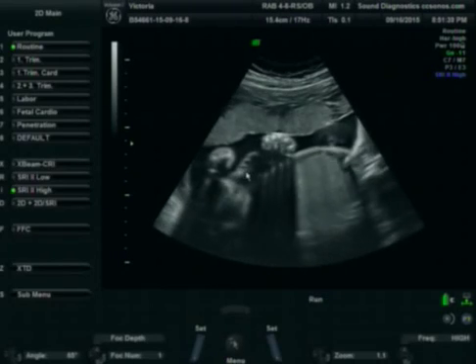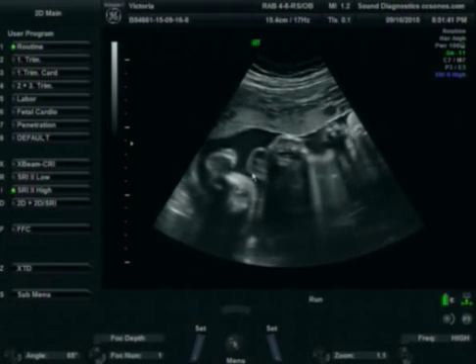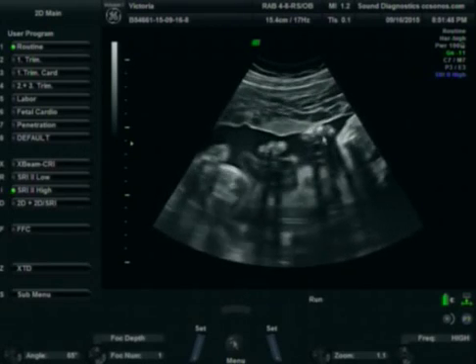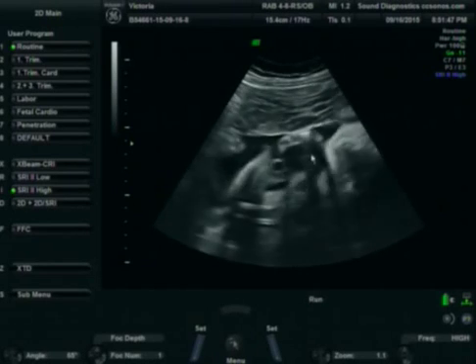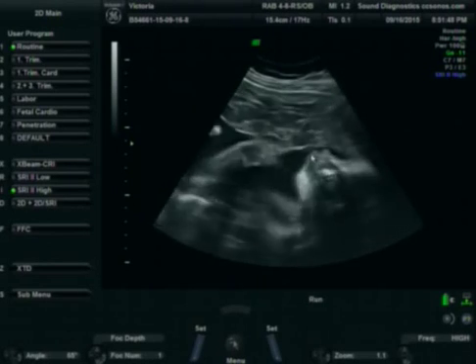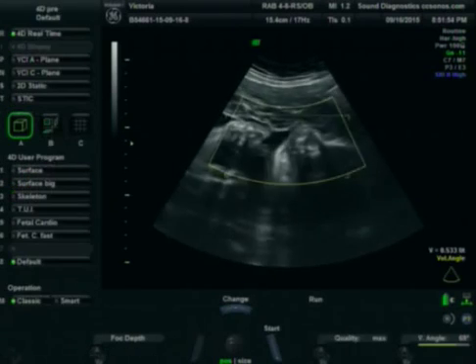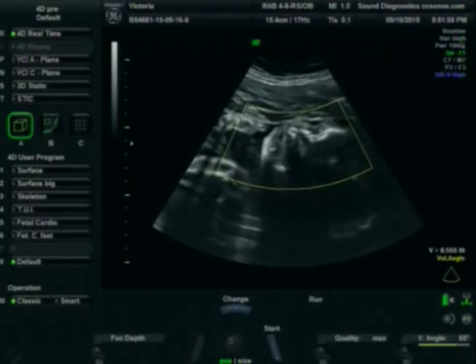Right there, the little bubble-looking things, that's the umbilical cord. You can see it's actually right there by the hand. It looks like the hand is over here too, the little fingers trying to grab onto the umbilical cord. I think when they pull and grab on the umbilical cord, that's when they're ordering womb service. She plays with it a lot. Yeah, the last ultrasounds we've had, she's been playing with it.